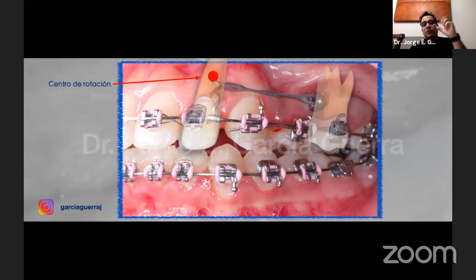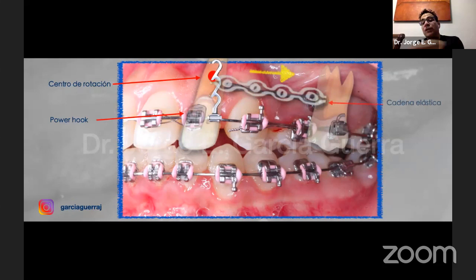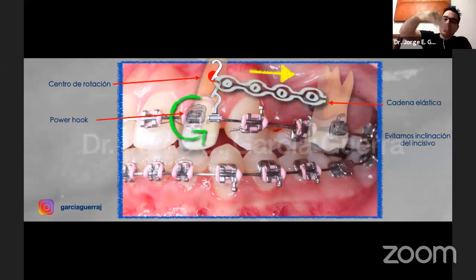And what we're gonna do here, we're gonna put this power hook. You can see on the picture that it has three levels. You can cut them, you polish them, and it's a crimpable hook. You put them on the arch wire. Now we're gonna put a power chain at the level of the center of resistance. We try to do this to avoid that negative effect of the torque, to avoid that overcorrection of the overbite. That's why we put the mini implant in this zone when we're closing spaces. So it helps us to avoid that.